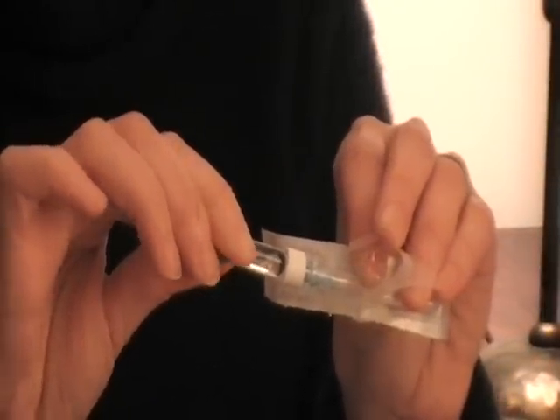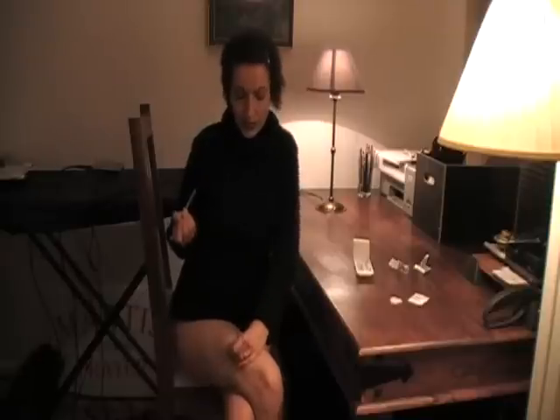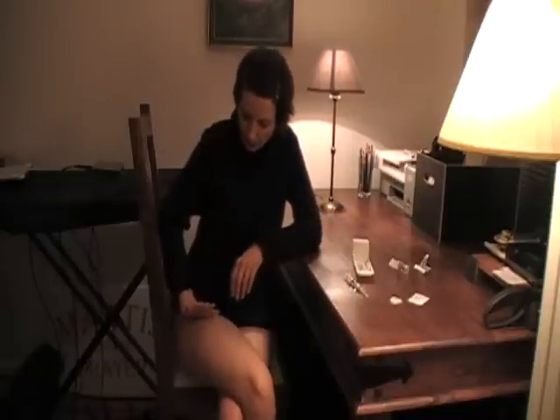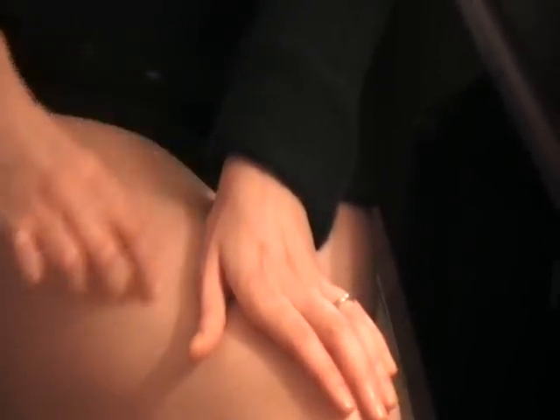And you simply twist it. Now you're ready to drop trowel. The way you'll inject the needle is to put it 90 degrees in, so at a straight angle to your skin. If you do subcutaneous injections such as Rebif, you pull your skin up to do those — that's not what you do with Avonex. Avonex is actually the opposite; because it's intramuscular, you need to spread that skin almost down. I'm injecting in my leg tonight. How do you find where you need to inject? Take one hand and put it on just the top of your groin, take your other hand and put that at the knee — the spot in between will be the place where you should inject.